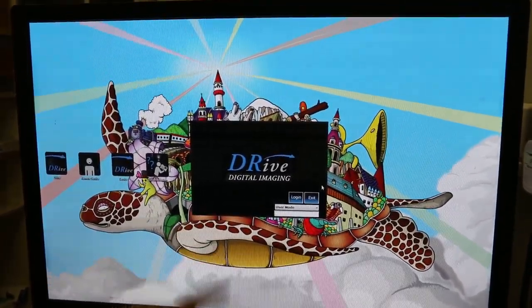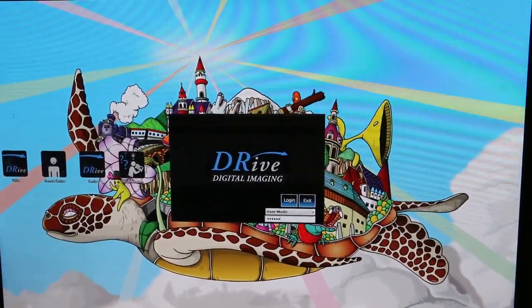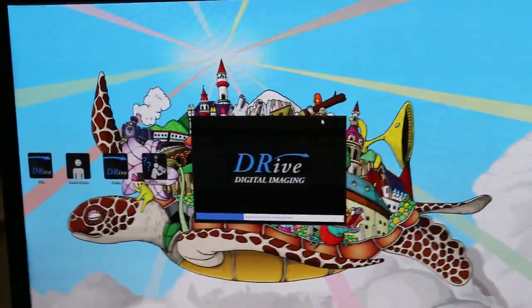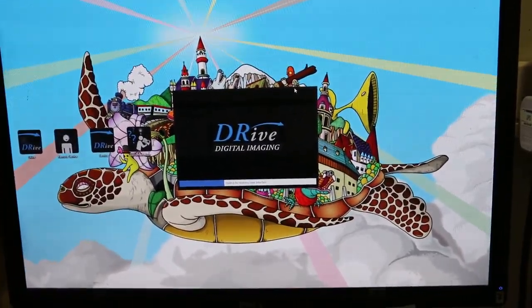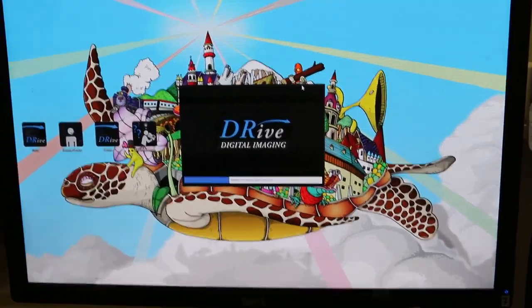We're going to x-ray the red-eared slider. Doing the settings now — digital x-ray — then do the settings.